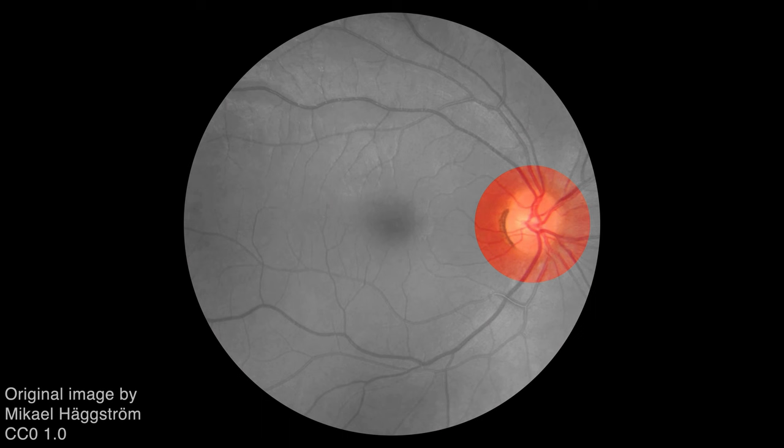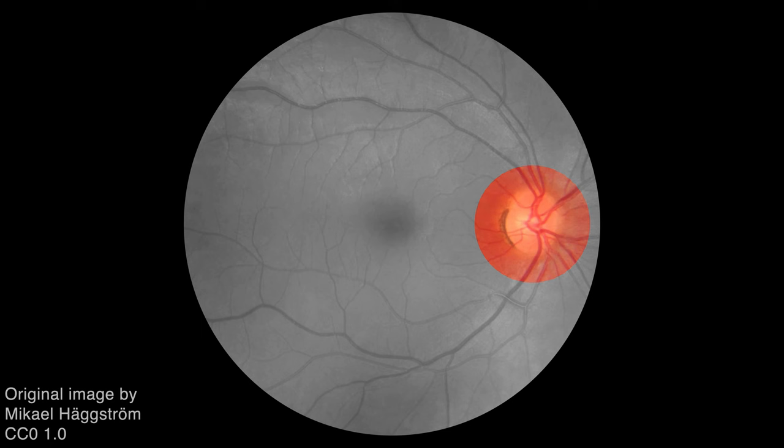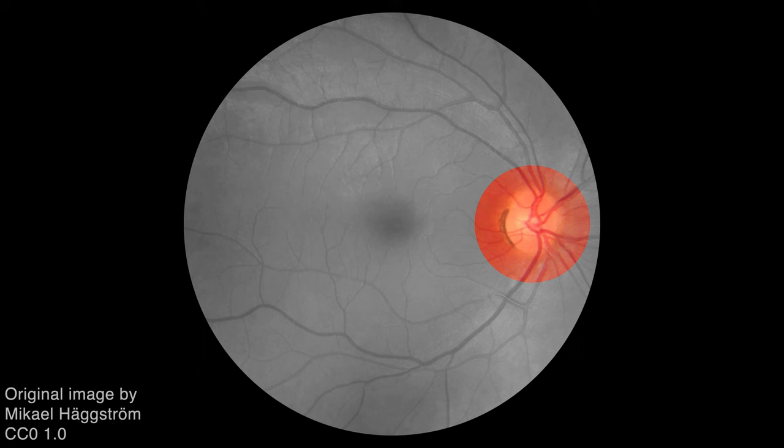Here we will focus on the optic disc, which is usually pale orange to pink in color, is round with sharp margins, and has a cup to disc ratio of less than 0.5. In this case, there is a small degree of non-pathological pigmentation at the periphery of the disc.